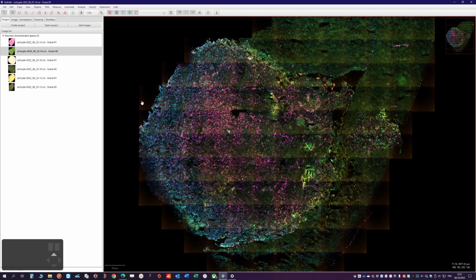In order to do that, there's a tool here in classify, training image, and let's say if you have really a lot of images, you could split your project into train, validation, and test subsets. This would be the ideal case, but most of the time it's not like that.